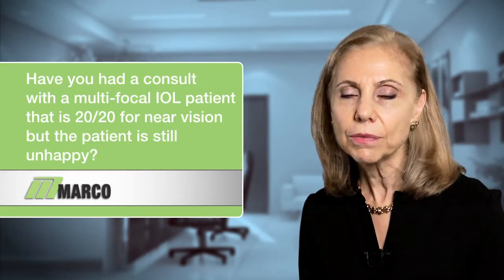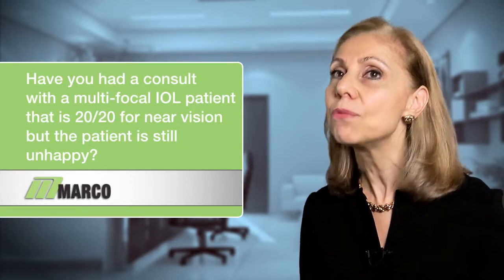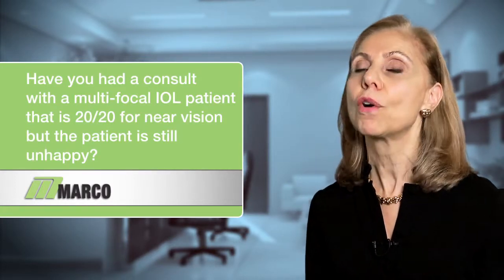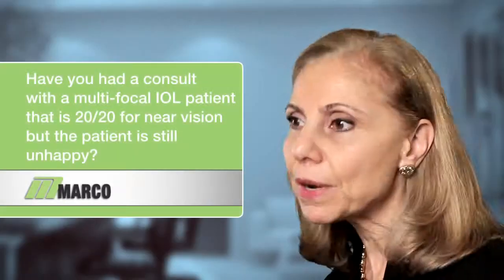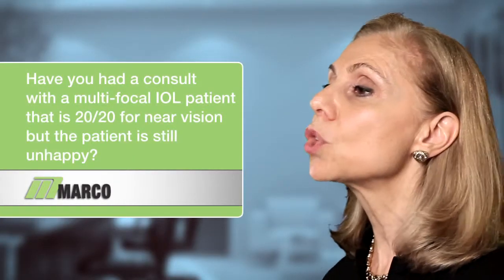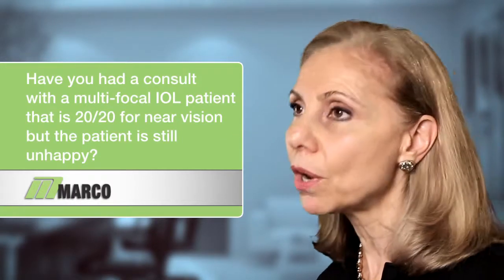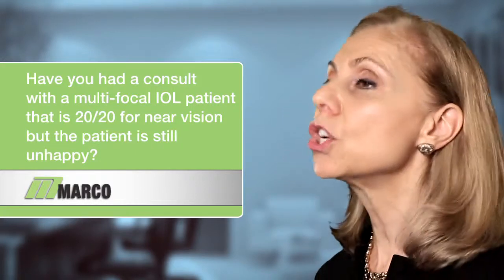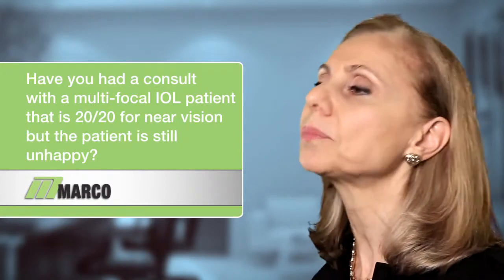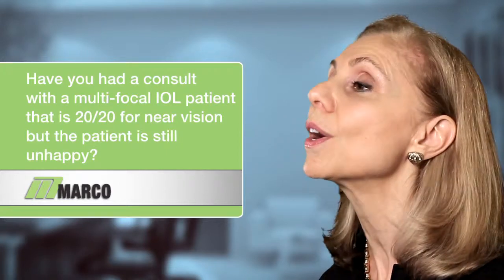So after a variety of testing, including the OPD-3, I realized she had a very large positive angle kappa, which meant that her visual center was different than the anatomical center of her eye, of her pupil. So even though under the slit lamp her multifocal implant was perfectly centered within her pupil, she was having significant issues with night driving.